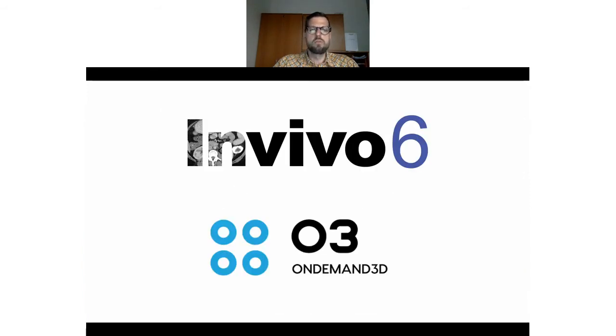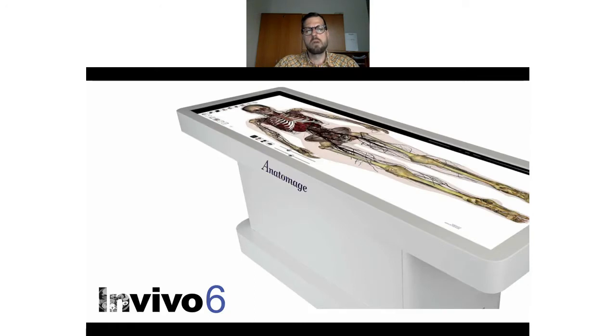So what about the software? We have two choices. In the KaVo units, you can have the In Vivo 6 software or On-demand. On-demand is more suitable for implants. So we will talk today about the In Vivo 6. The In Vivo 6 is made by the company Anatomage from the United States, and they are doing a lot of stuff for imaging. For example, these tables where you can learn something about anatomy.